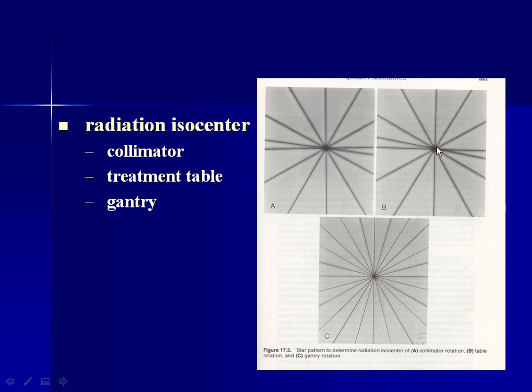Actually, I usually bring films. I didn't do that. But if you blow this up, you can see these all intersect at some point in the middle here. You can see these aren't perfect, it's a little bit of a star pattern in the middle. So we try to measure the greatest distance where these intersect in the middle. I'll have to blow that picture up next time.